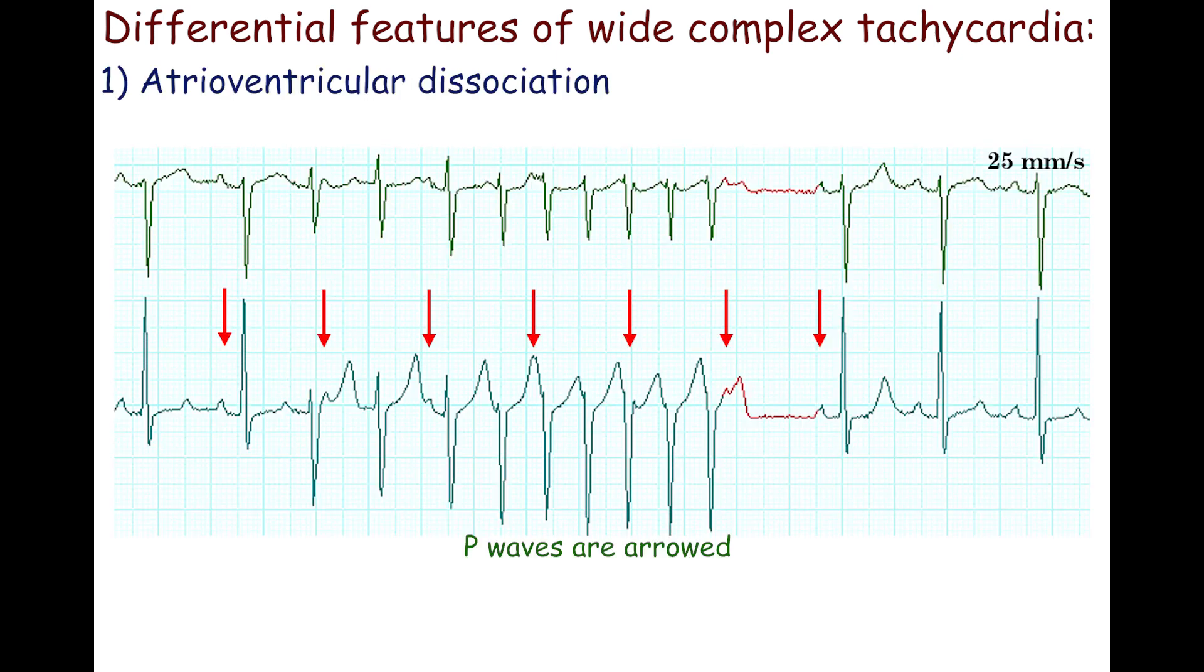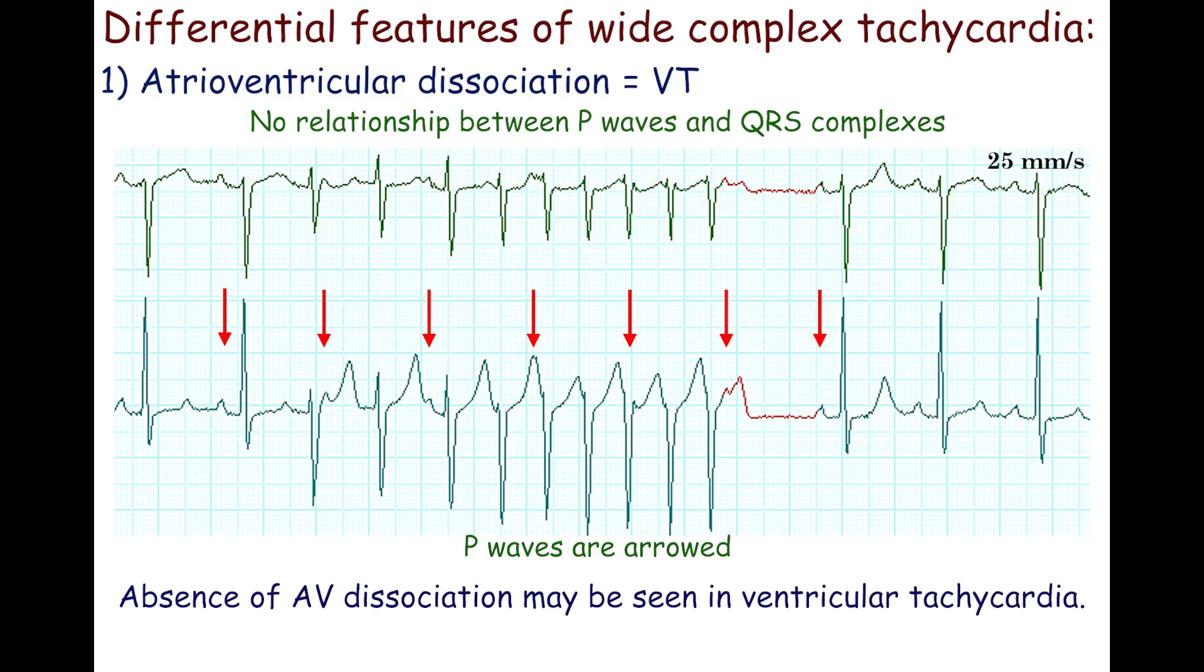The first feature is atrioventricular dissociation. It is the absence of a relationship between P-waves and QRS complexes. This is an exact feature of ventricular tachycardia. P-waves are arrowed. There is no relationship between P-waves and QRS complexes. Pay attention to regular PP intervals. Note that absence of AV dissociation does not mean that it is not ventricular tachycardia.